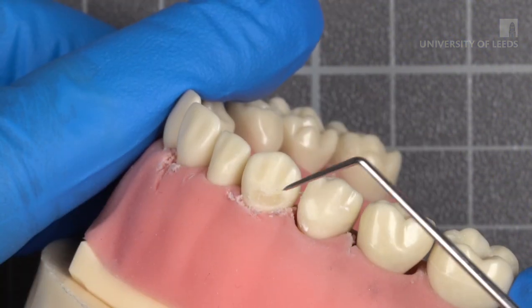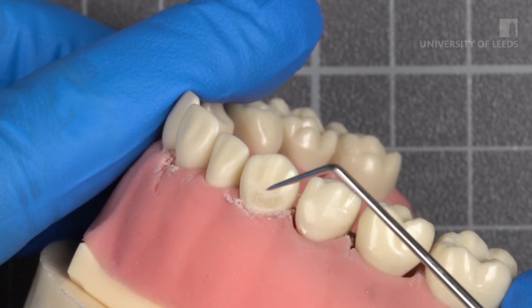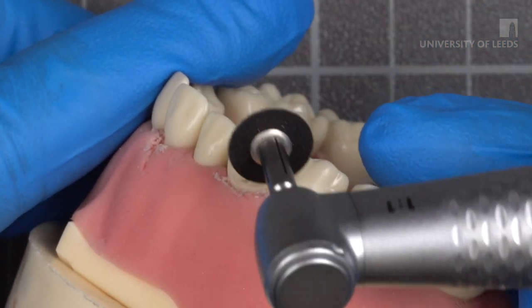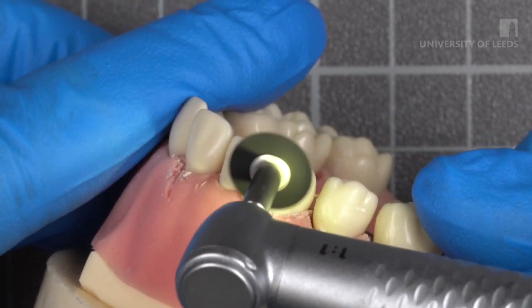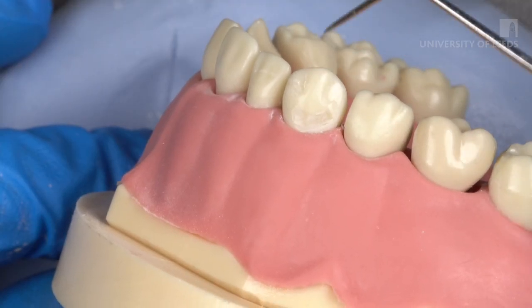Check for any material deficiency with a number 9 probe before moving on to the next step. Check for any flashes with a probe and smooth the margins with polishing discs, starting from coarse to fine. You may need to hold the soft tissue away while performing this step. Finally, verify smoothness with a probe.